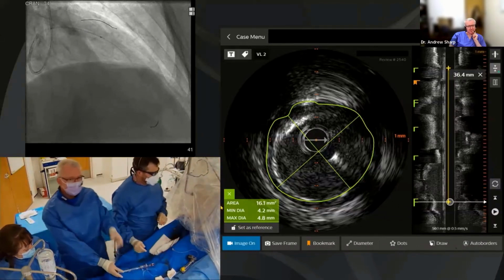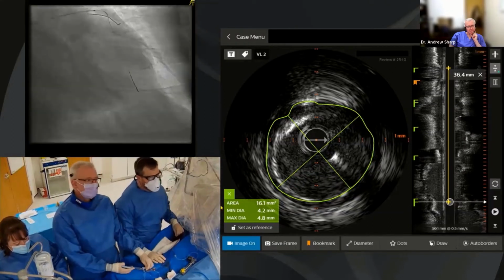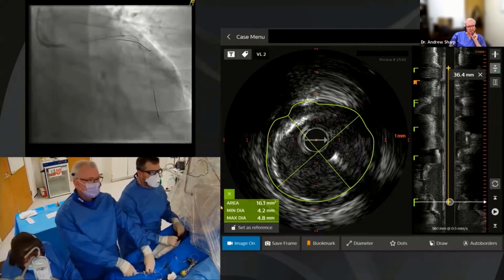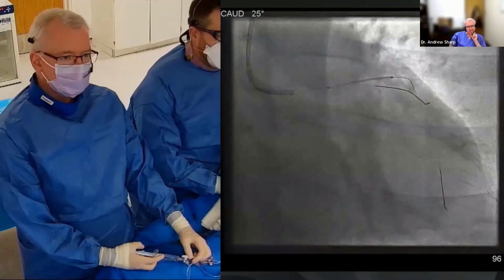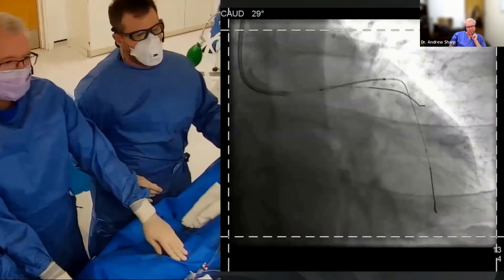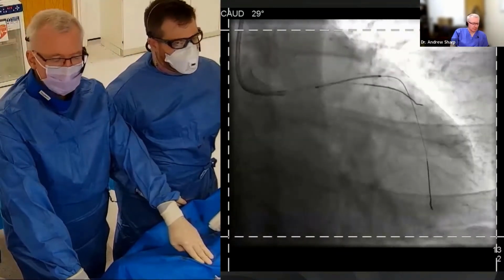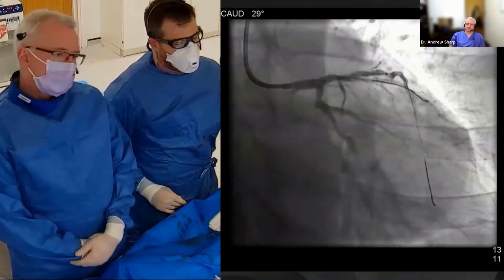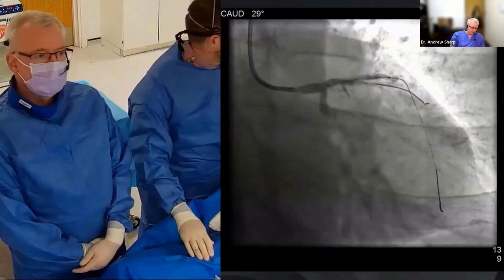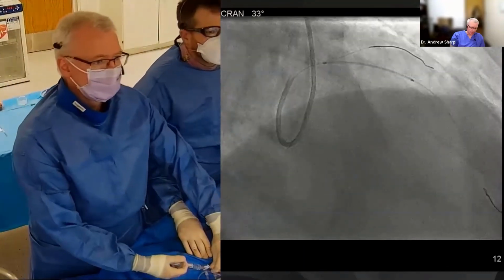So one of the difficulties with this, Sean, is how we pot the proximal segment, because it's such a short segment. Send it up, please, Rach. Prox LAD. Yes, no. And we'll just picture that. Good, yeah. Good. Okay, so good. We don't have to be true osteal. We've seen that it's healthy. Let's come cranial, please. That whole segment of prox LAD is healthy, so we don't have to land at the ostium. Good.